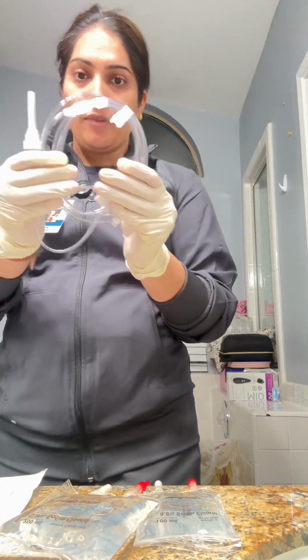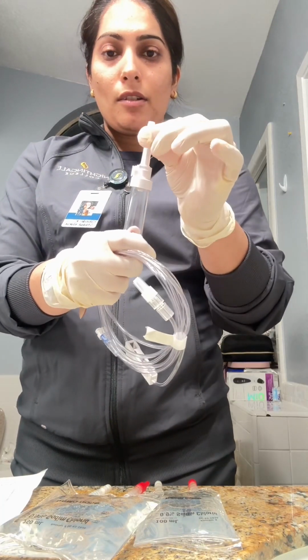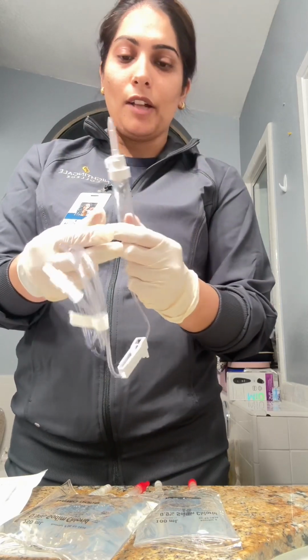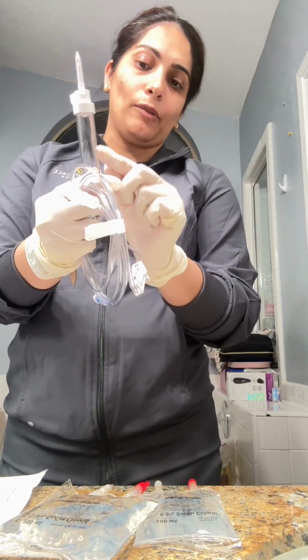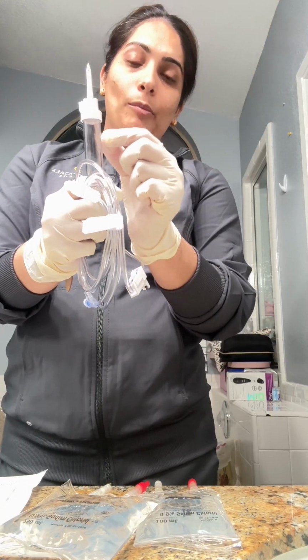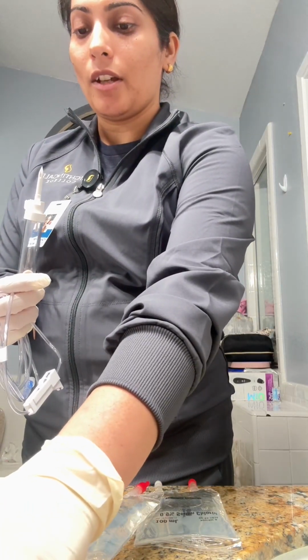And this is the IV line. This is the spike end, which goes into the IV bag. And this is the drip chamber, which gets filled with fluid halfway. This is how we calculate how many drops, and whether the IV is running okay.